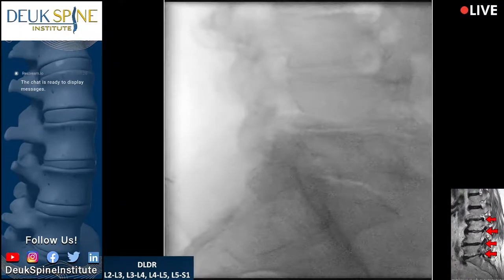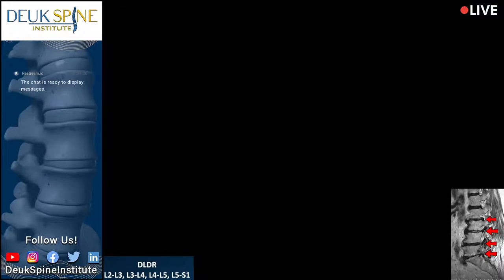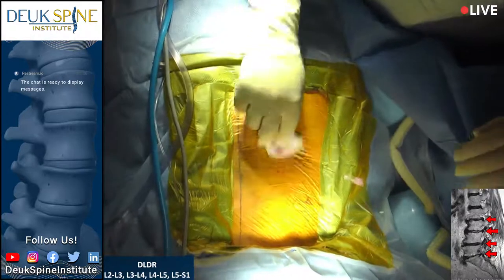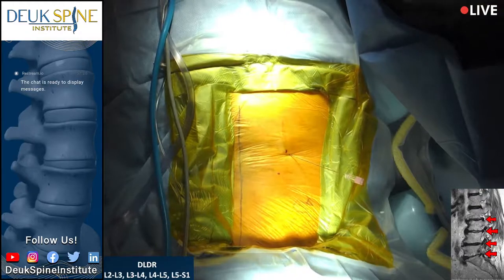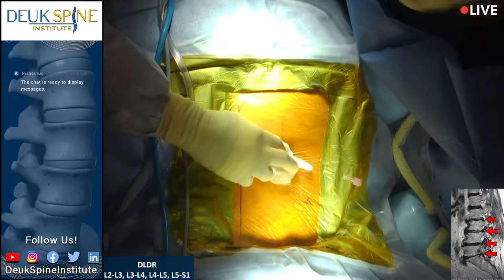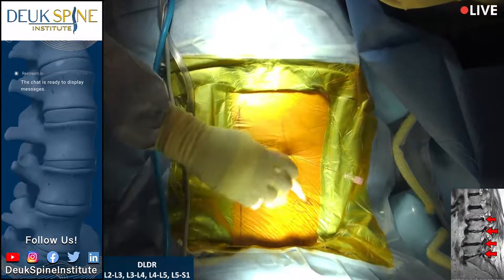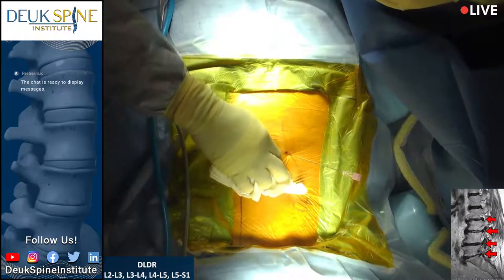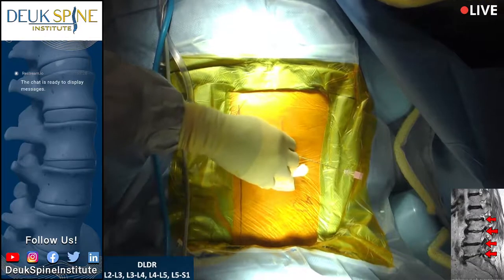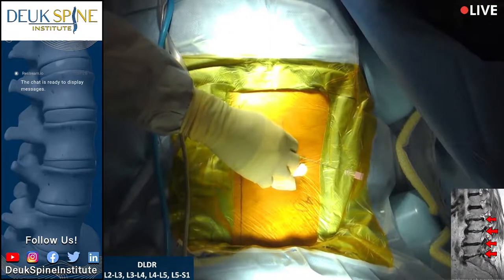Okay, so our patient has degenerative disc disease. He's over 80 years old. He doesn't want to live in pain anymore, so he came to us to have his disc fixed. Now he has not only these degenerated discs. Can you show me? I'm going to be talking to my technician, Jordan. I think our orbit's off a little bit. I'm not seeing the foramen at L5-S1. I'm not seeing the S1 end plate.